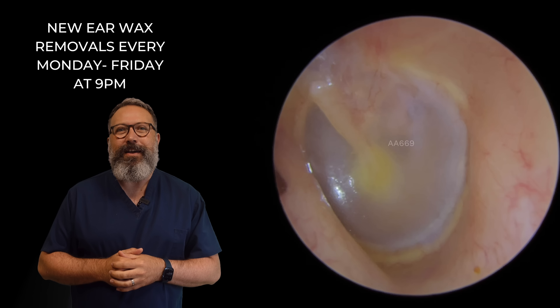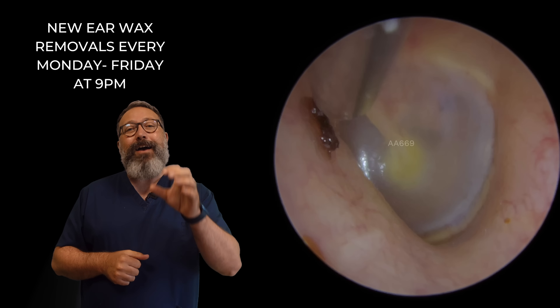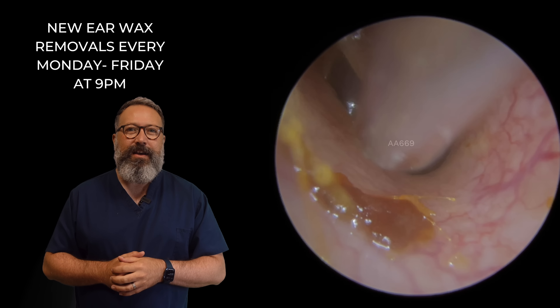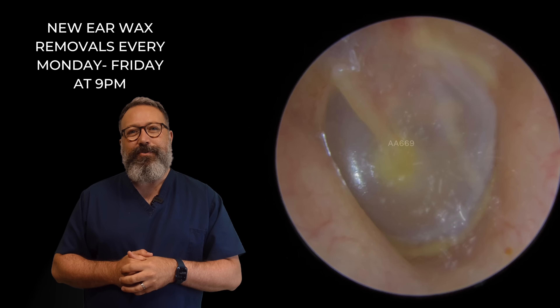And if we take a look behind, there we are. Oh, look at that one piece. We'll leave that one there — and now we won't, of course. We're going to grab that bit as well. But you can see the eardrum beyond looking really, really healthy there. Let's grab that little section. And should we take that bit out for good measure? There you go. Let's give it that bit as well. So it looks really healthy in there. There's the eardrum looking much, much better than when we started.